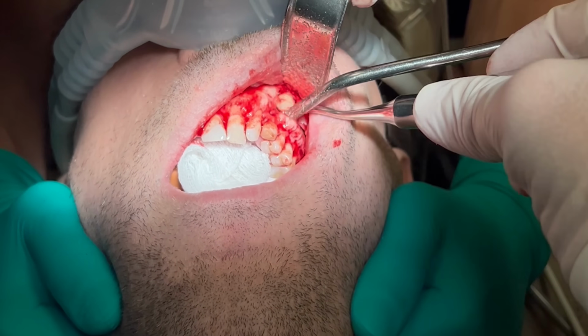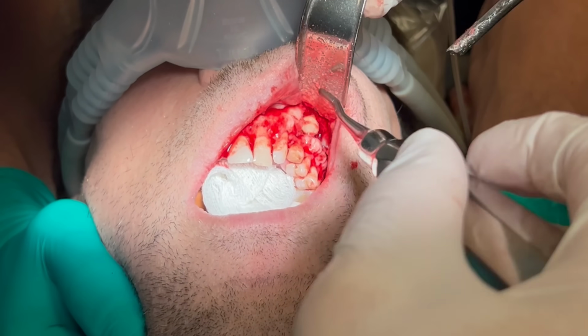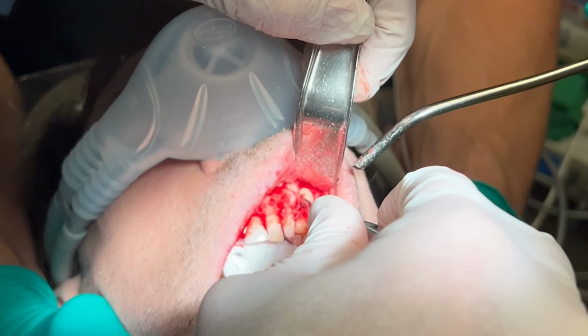Now that I can see the crown and a large portion of the root structure, I elevate and remove the majority of the canine.